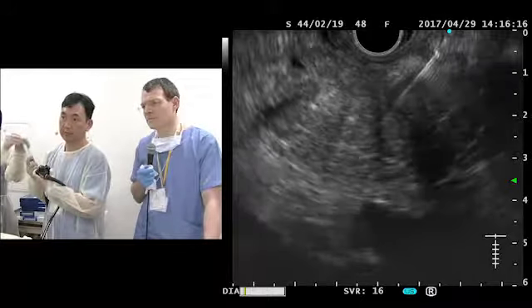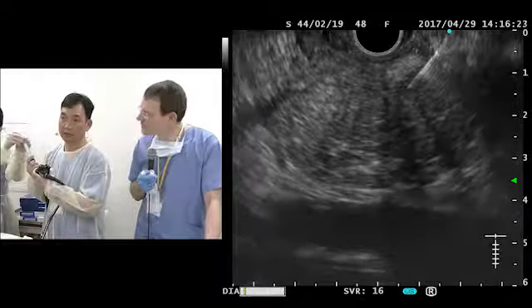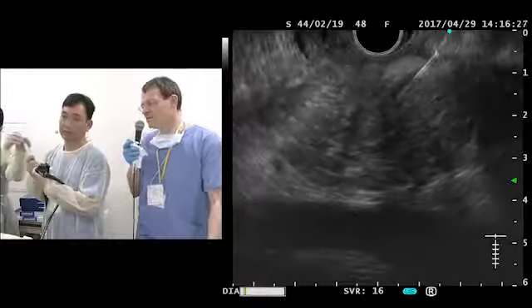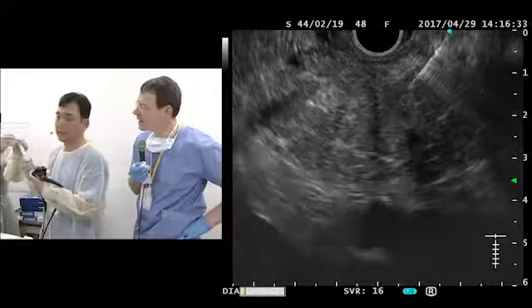I can feel a gradual push. That's interesting. Almost feels like a serous adenoma type of feeling. What is your position on using suction or not? Yeah, so keep going, keep pulling, like a steady pull.